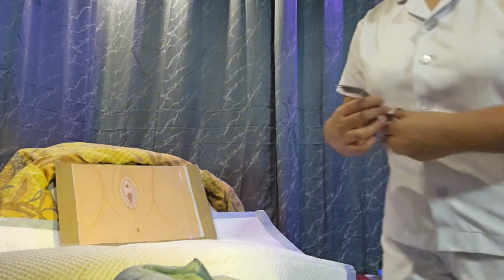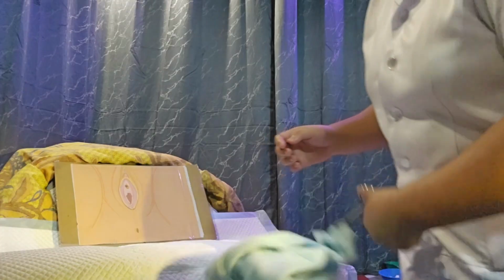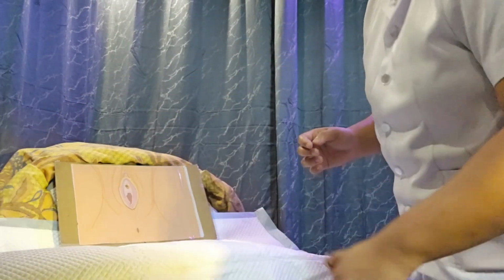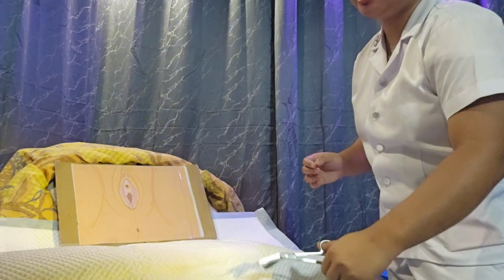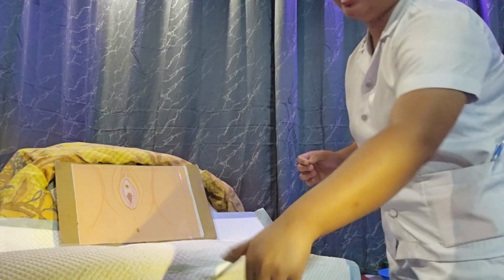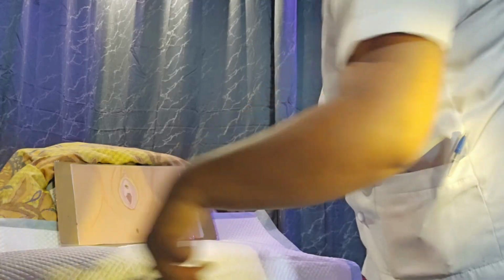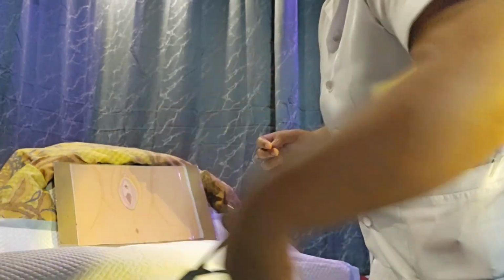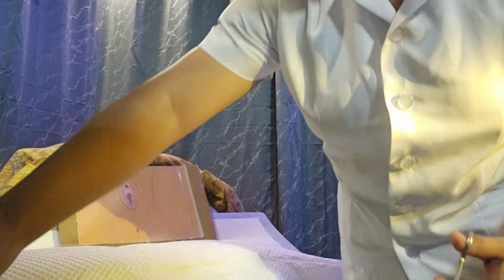So after we ensure that the patient is already comfortable with the position, we are now going to identify the equipments to be used. So the equipments that are needed for this procedure are the following.